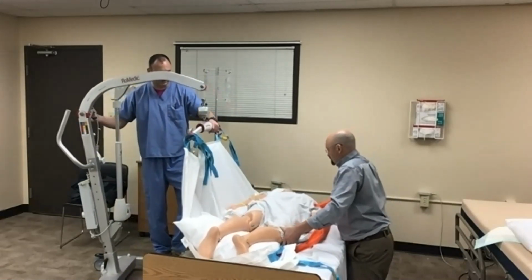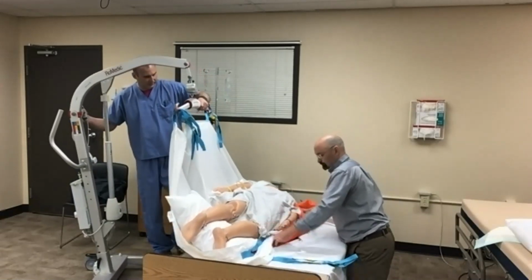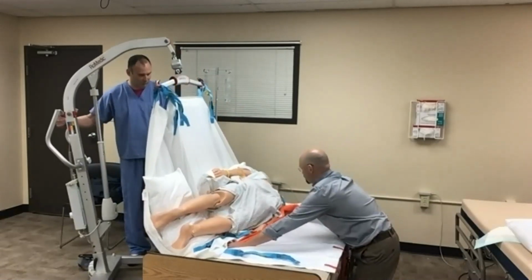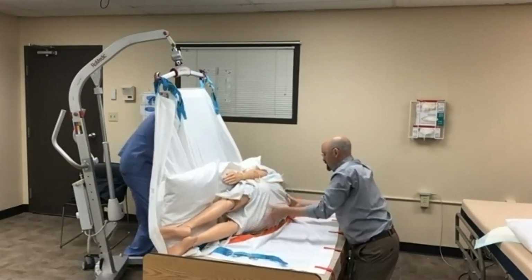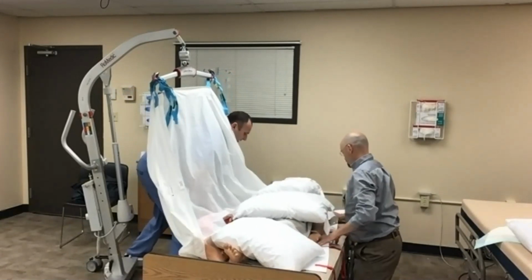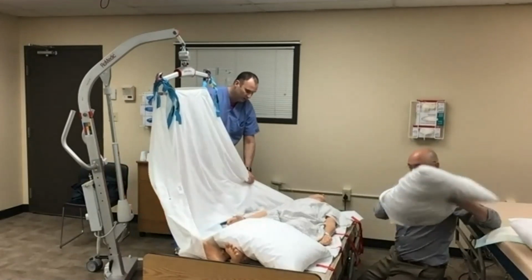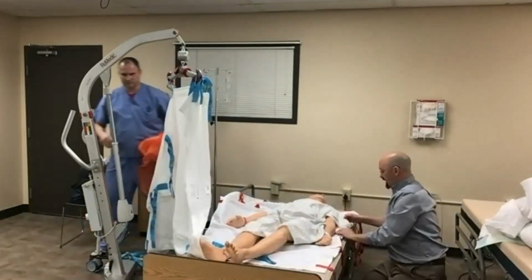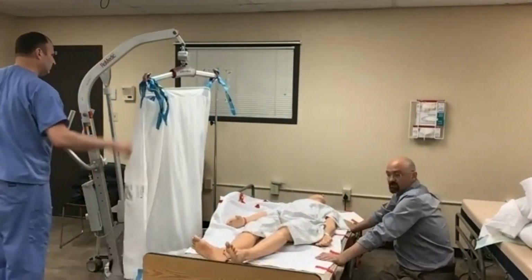So if this were a ceiling lift, we would have this positioned in a different spot. Again, the lift is doing this work, not me. Once we get them where we need to, I'm going to give a little push and a little pull at the end with the slide sheet. So now that's where it needs to be. And he is then ready to go on your second surface, on your repositioning sheet, so you can start the process over again.